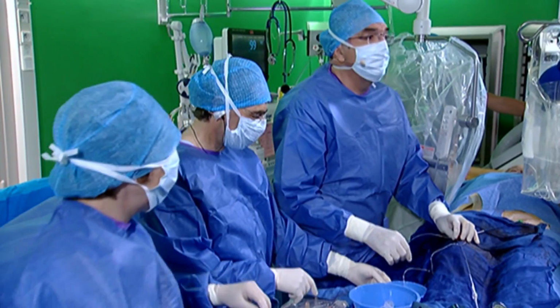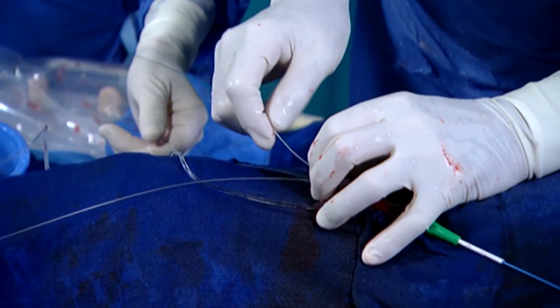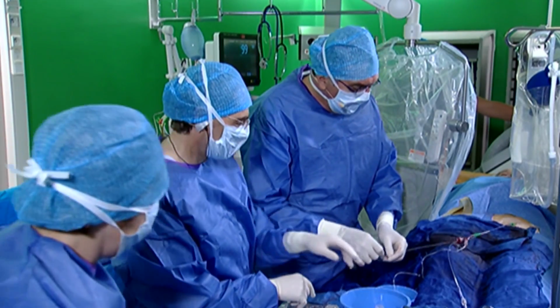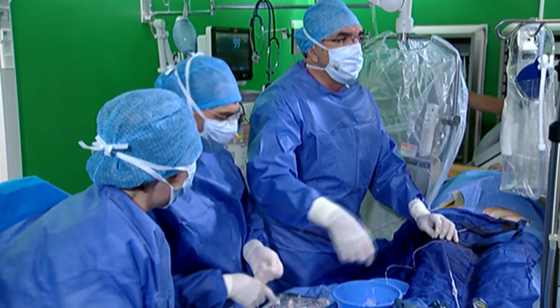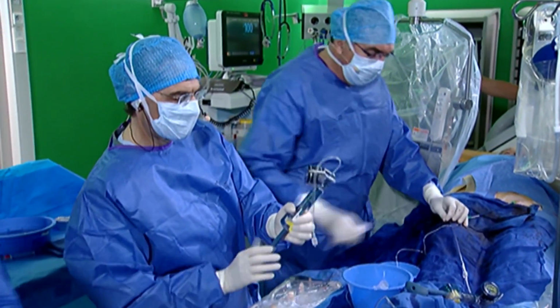Yeah, give me a new one. Give me a 4.0 compliant. Keep the guide. Do you have it? Okay. 4.0 by 15.